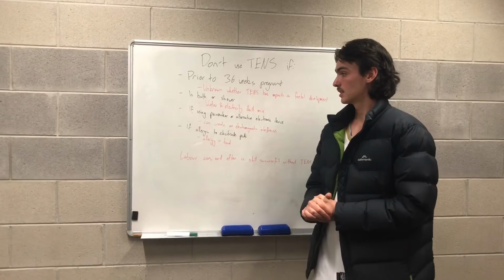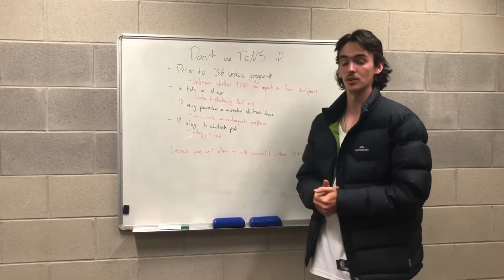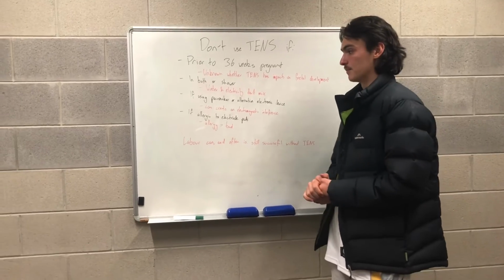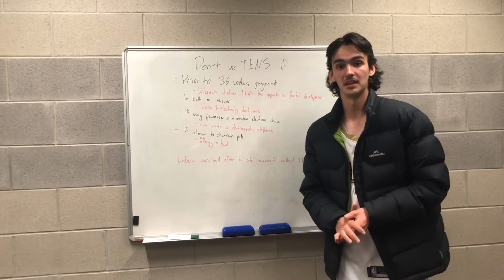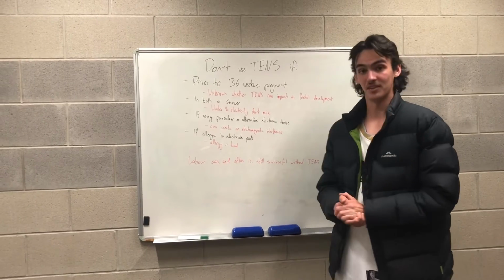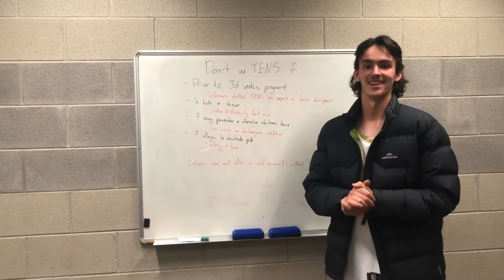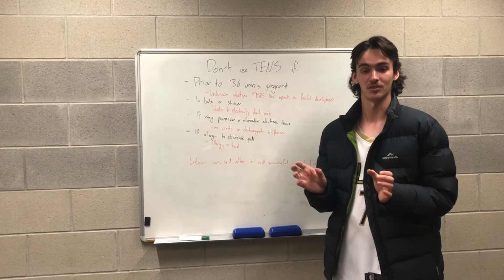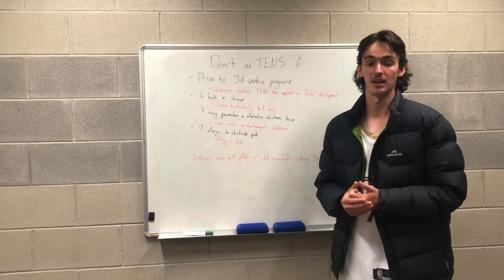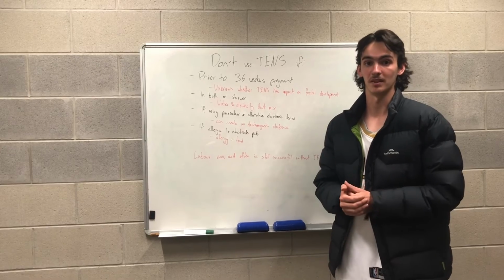The next situation would be if the individual has a pacemaker or any other form of electronic device. If this is the case, then it could create an electromagnetic interference, which essentially means that with the two electronic devices being used at the same time, they have potential to both fail and not work to the best of their capabilities.